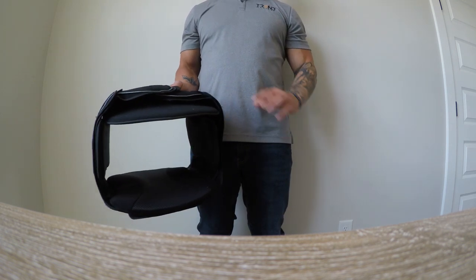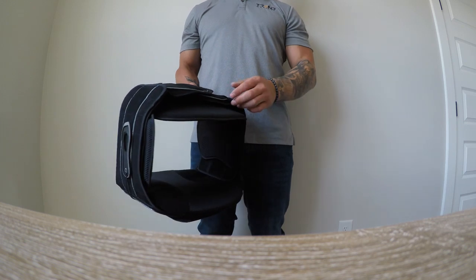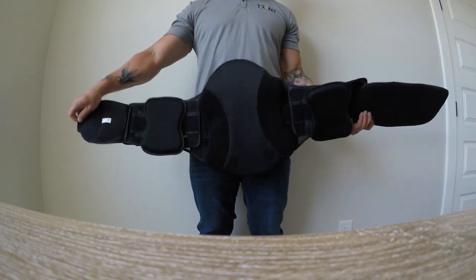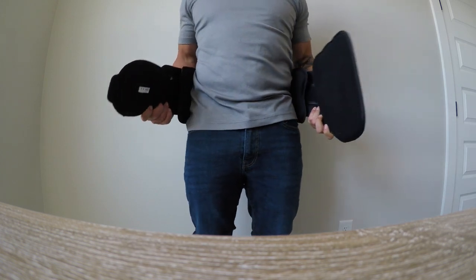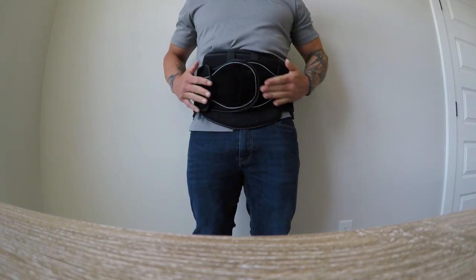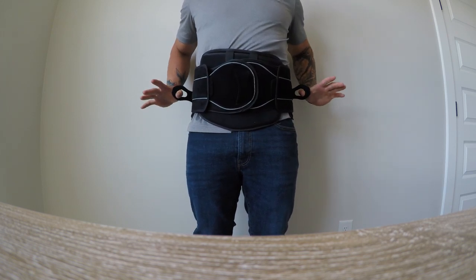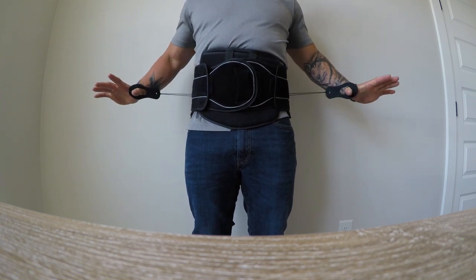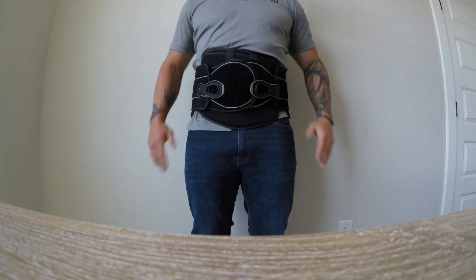Donning and doffing the Trend Extend LSO, the Trend Pro LSO, and the Trend LSO. Simply, the patient, once sized, opens the brace, wraps around his or her waist, and closes low across the front. The patient then reaches for the loop tabs, un-velcros, and pulls to their desire, wrapping them low across the front — it'll hold compression for the patient.